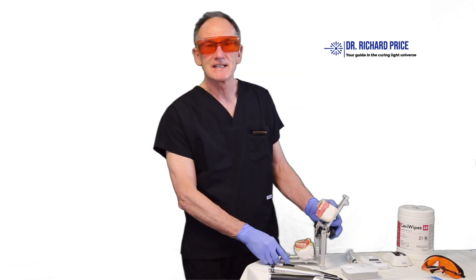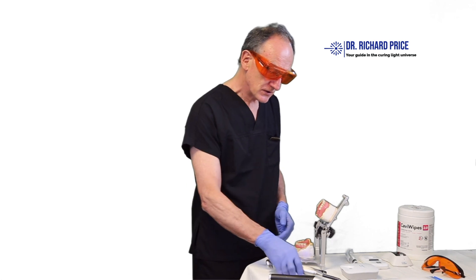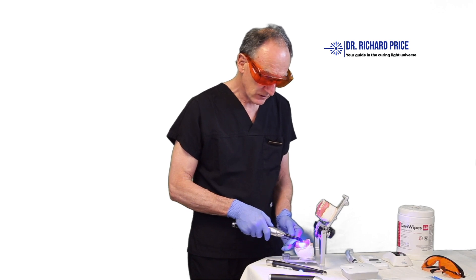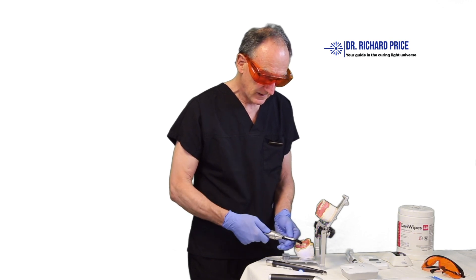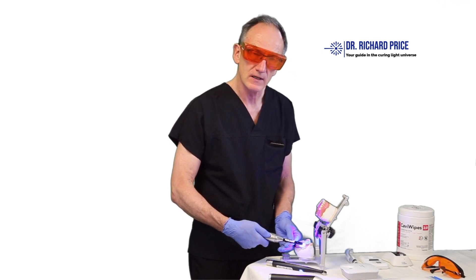The next tip is to light cure from the sides as well. Not only should you cure from the top of the tooth, but after you've finished the initial exposure, always light cure from the lingual side and then from the buccal side as well, to make sure all parts of the restoration are properly cured.